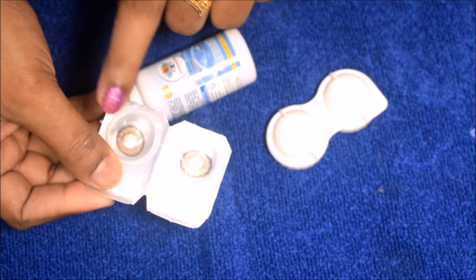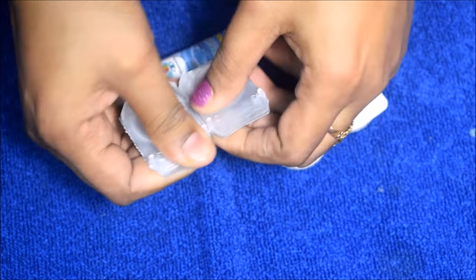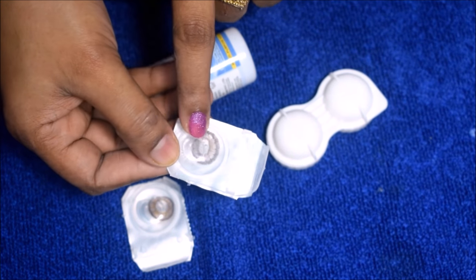I am using this lens for the first time — I will open it and show you. I have already added the solution, so you can apply it directly. You don't need to clean it separately.